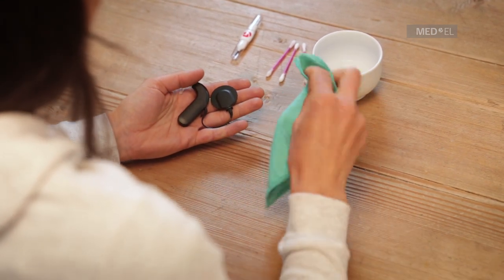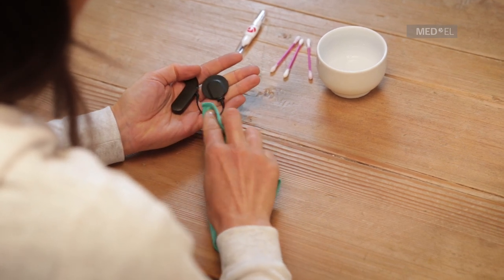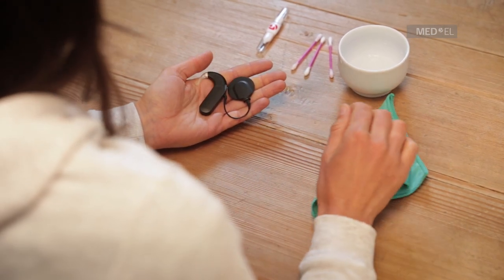Clean Sonnet regularly by wiping it with a soft damp cloth. If the microphone covers get wet, wipe them dry, use the drying kit, or replace them.